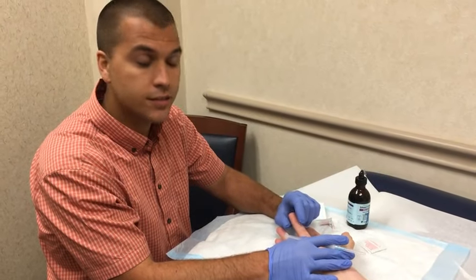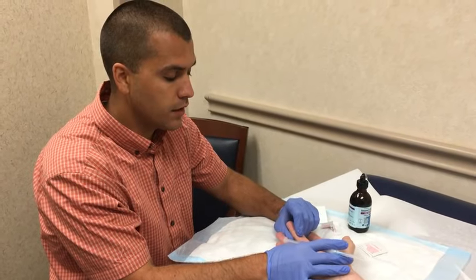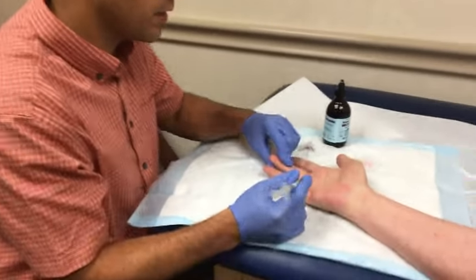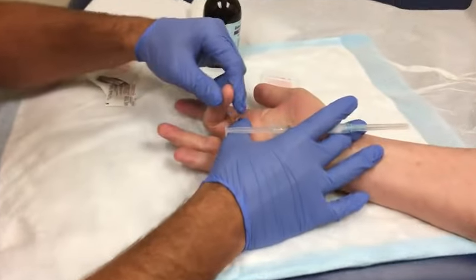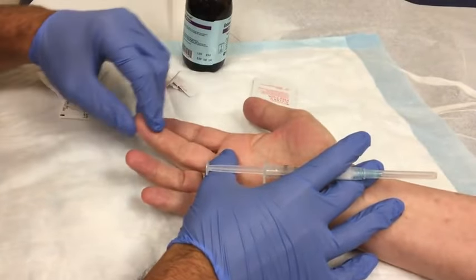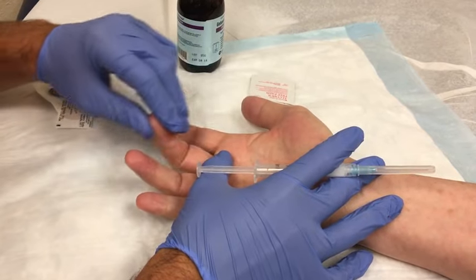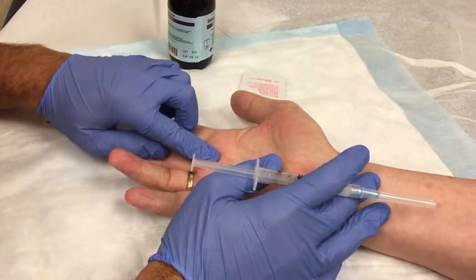My name is Dagen Cloutier, Physician Assistant, and I'd like to show you my injection technique on a trigger finger. We'll bring the camera in. You can see I'm flexing and extending the finger to feel the active triggering of the finger over the A1 pulley.